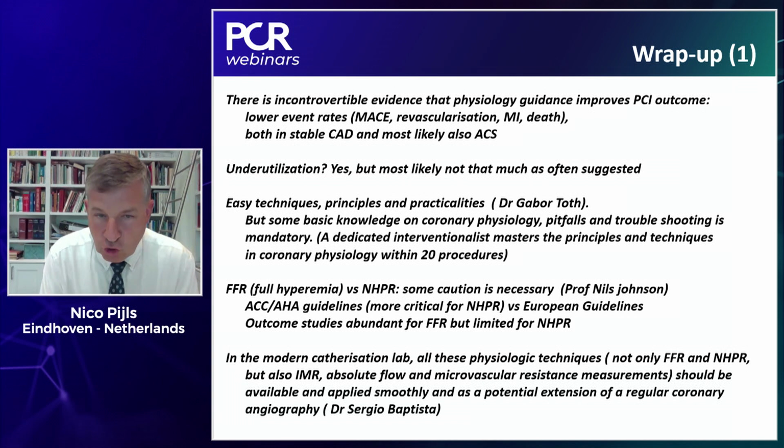Gabor already mentioned that you do not need to measure FFR in every case. If a patient has typical angina, a positive stress test, and 1 severe stenosis on the angiogram, then 1 + 1 + 1 is 3, and we need to do a PCI, and we do not need to measure FFR. Also, in acute STEMI, as discussed by the speakers, most often the ECG guides you in selecting the culprit lesion.